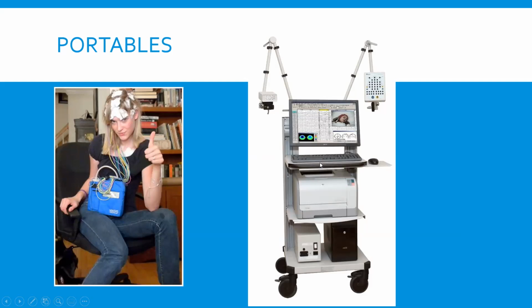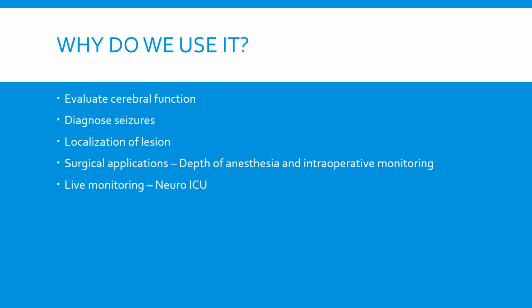I actually have regular meetings with our EEG technicians, and they want me to remind you guys that when you're moving the patients from the UCC or the ED up to the floors, make sure to replug the EEG connection back to the portable machine and not to the walls, because the study is running on the portable machine. So when you reconnect them on the floor, make sure you reconnect to the portable machine.